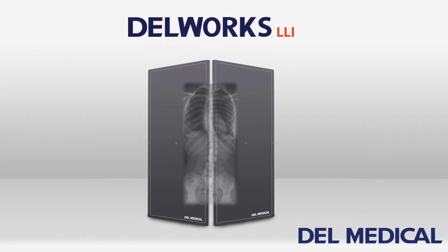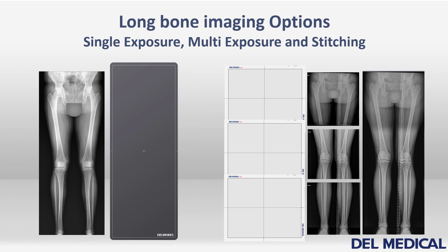This is the DellWorks LLI Full-Length Flat Panel Direct Digital Detector by Dell Medical. Before introducing DellWorks LLI, we'll describe some of the other approaches to long bone imaging that exist today.